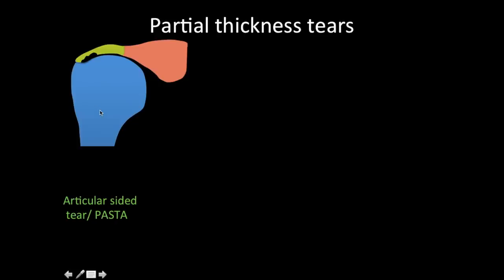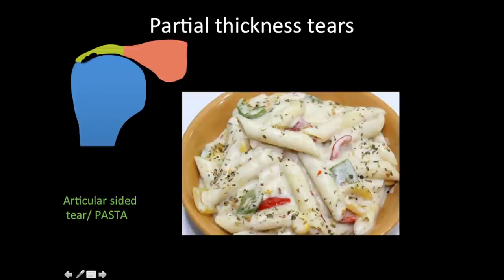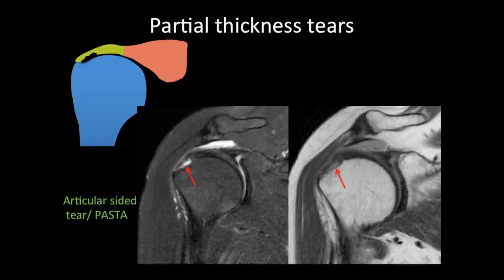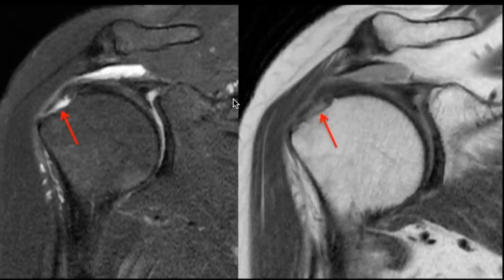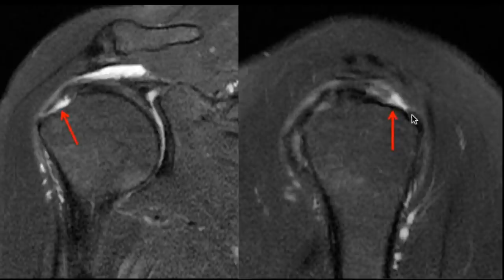This is also called PASTA — partial articular surface tendon avulsion. You do not need to mention the term PASTA in your report; what is more important is to describe the tear. For example, this patient has an approximately 75% thickness partial articular sided tear at the supraspinatus enthesis, with some bursal fibers still intact. On the sagittal image you can also identify the anterior-posterior dimension of the tear.